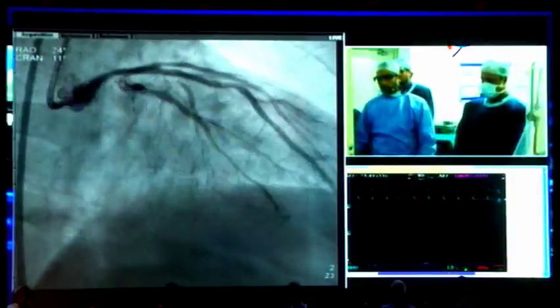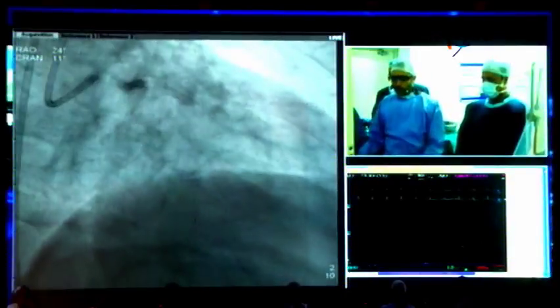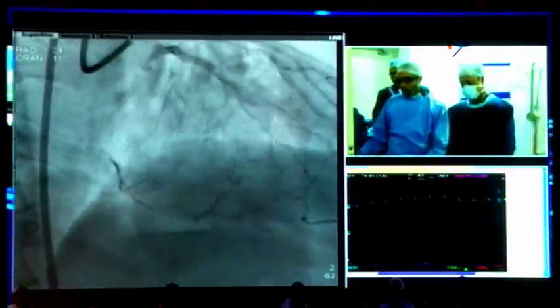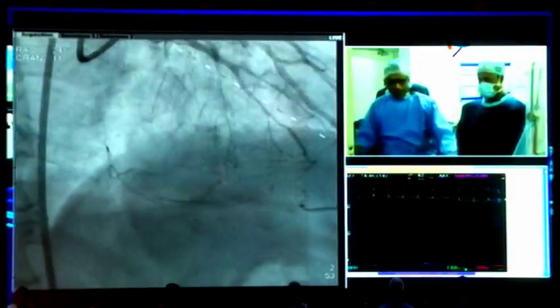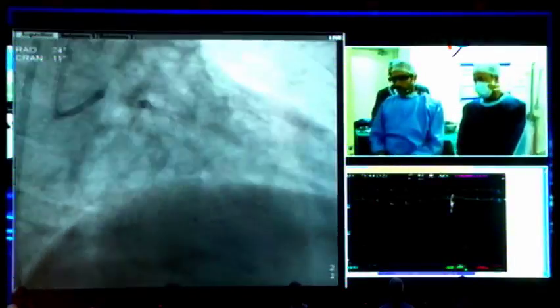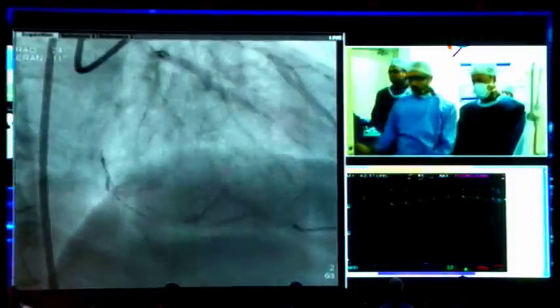We noted it. However, on popular request, we initially wanted to try and do this antegrade, and I think it's probably worth a shot. So we have started antegrade, but the point is well taken that if you're going to go retrograde, you might want to assess the distal left main to make sure the patient doesn't get super ischemic. So I think that's a very fair thing. We might have to do that, and if that be the case, we'll have to fix the left and live to fight another day for the right. I think it's an elective procedure. We've got to do it safely.